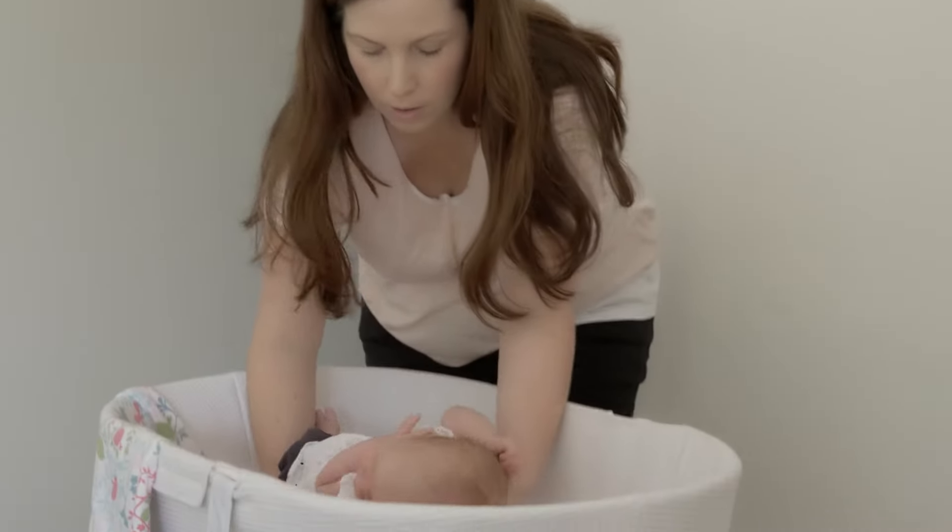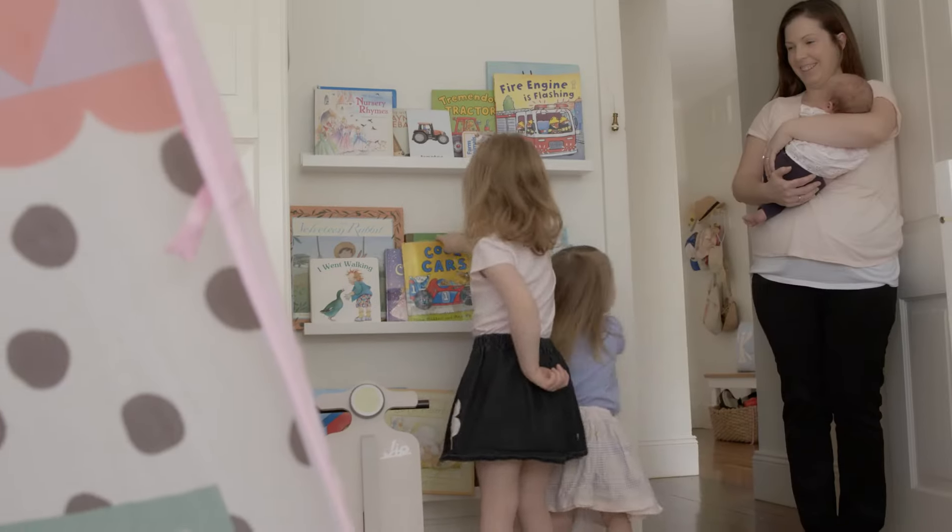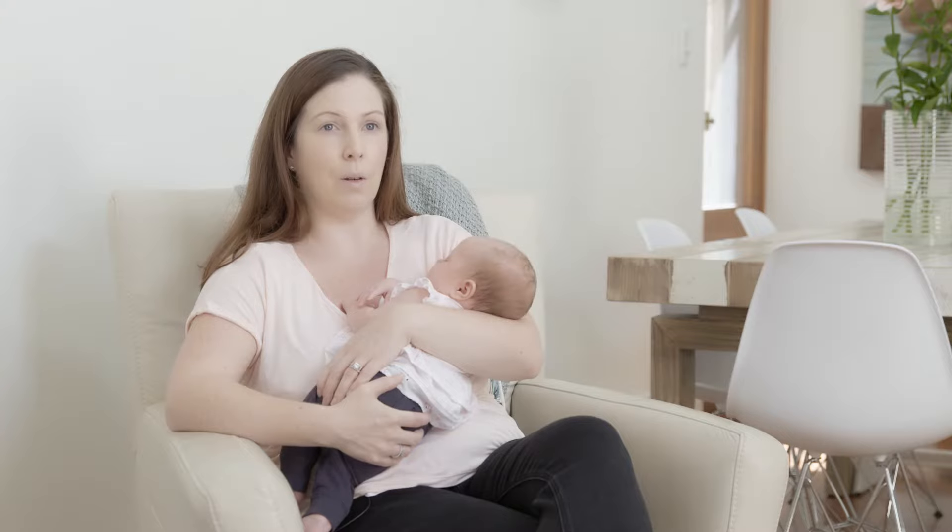I had an older pump that I really wasn't looking forward to using — it had a lot of parts and was really difficult to put together. So this pump is great for that; it fits together really well, it's easy to clean and sterilize.